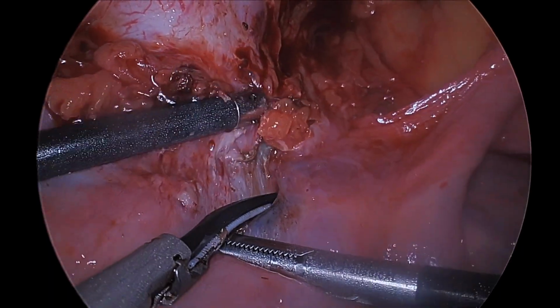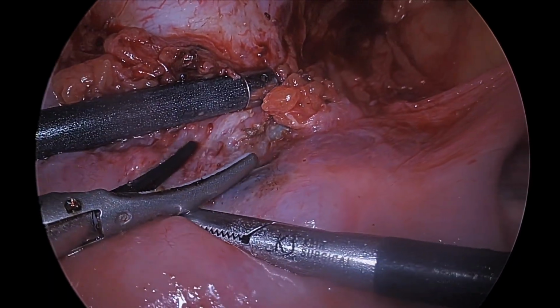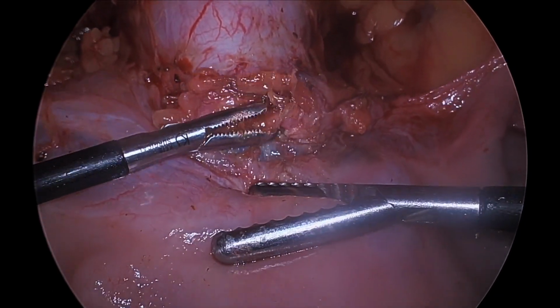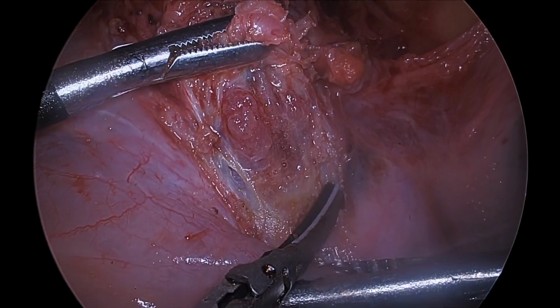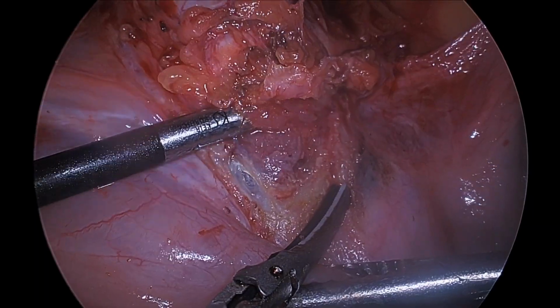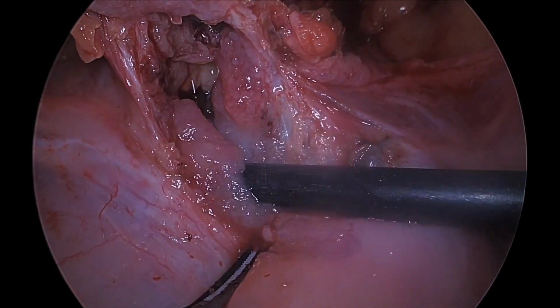Care was taken in an attempt to follow the spherical gestational sac to avoid resection of normal healthy myometrium. The overlying myometrium was confirmed to be quite thin, and we encountered the gestational sac quickly. Fluid was suctioned from the gestational sac and placental tissue was identified and removed. The fetus was then encountered and removed. The footage for this part of the procedure has been intentionally omitted.